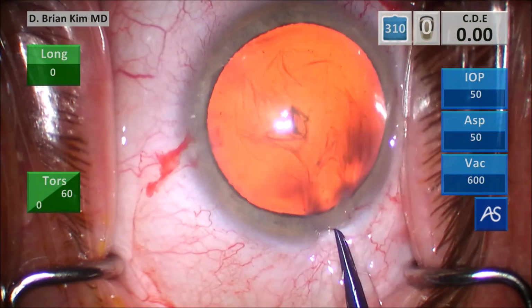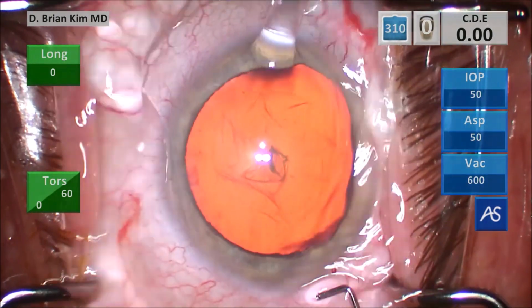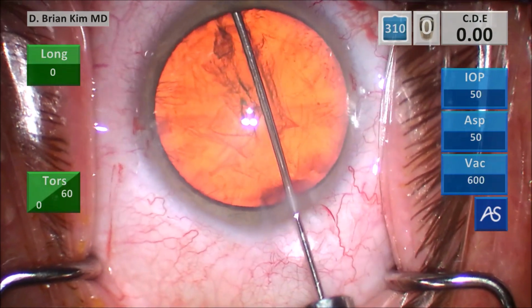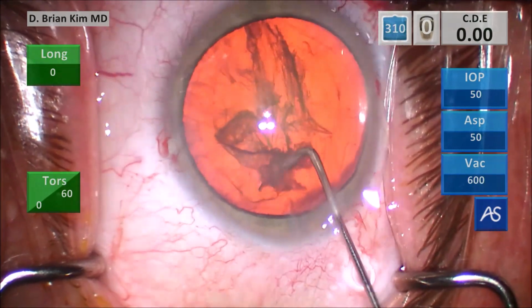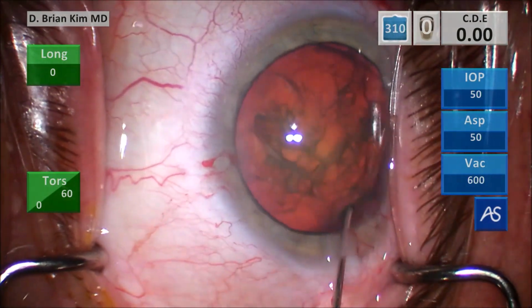We'll finish off the rexis, burp some viscoelastic out, and this is the capsular fornix hydrodissection technique. I place a cannula under the rexis edge contra-incisionally, get a gorgeous wave, decompress on the left side, sweeping under the rexis edge on the left side, hooking the peripheral lens on the right side, and the lens begins to spin.